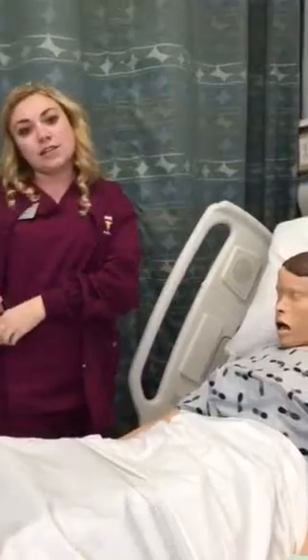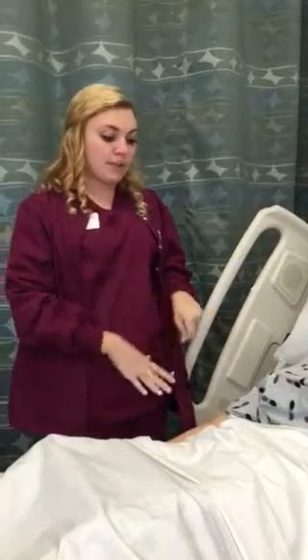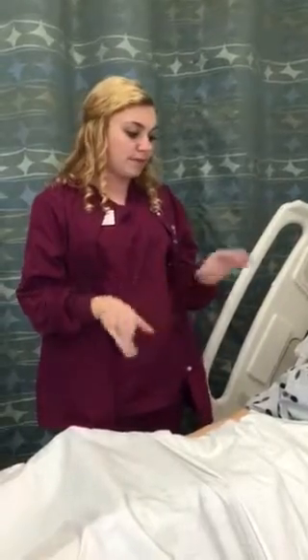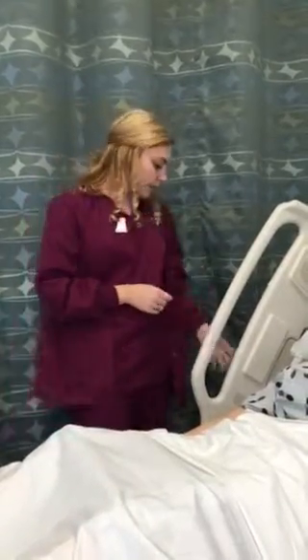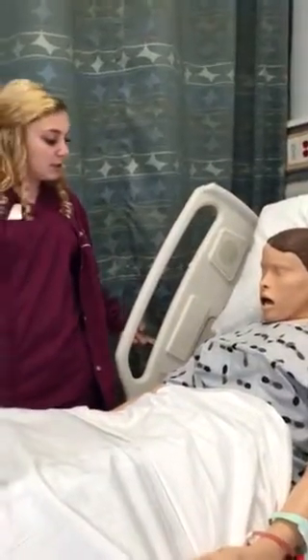Ask them if they've had any history of allergies or if they've ever had an NG tube before. In this case, she said no. Then I'm going to perform an abdominal assessment and see if I hear any bowel sounds because that can affect the tubing. So then I'm going to raise the bed up and explain the procedure.